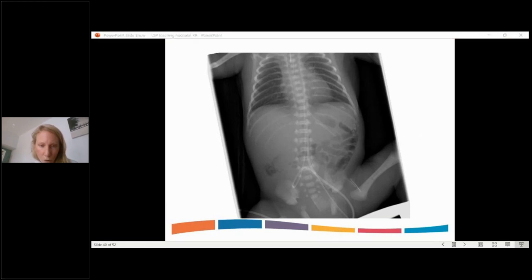So we've got one suggestion of a femoral fracture, which is great that we're looking at bones. I think you probably mean this bit, Katie. It's not a fracture, but well done for looking at it and spotting it. It's actually just the vascular line of the femoral bone. That isn't why I've shown this x-ray, but well done for looking at bones. Anyone else spot anything on this x-ray that is a little bit unusual?